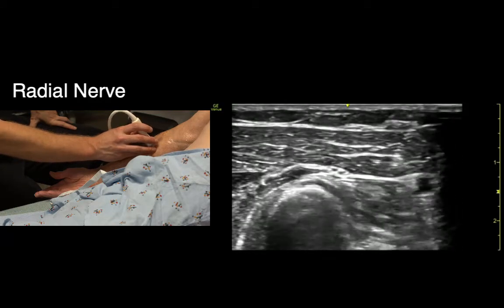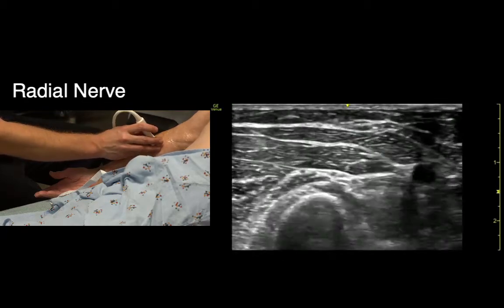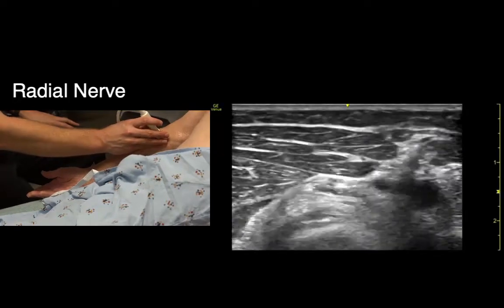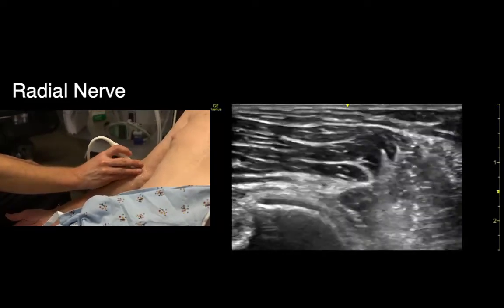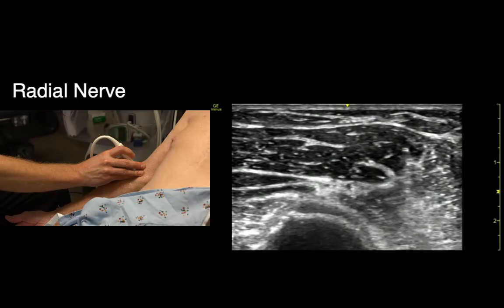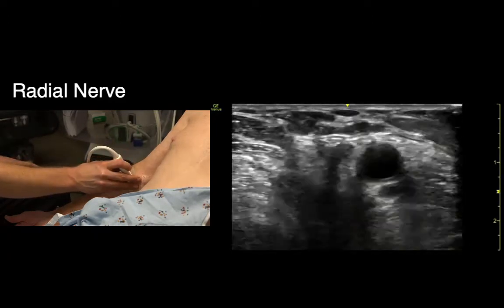As we go up a little more proximal, it separates — the artery dives away and the nerve is over here by the bone. And as we get up even more proximal, the nerve tissue is right by the bone and the brachial artery is way over here.